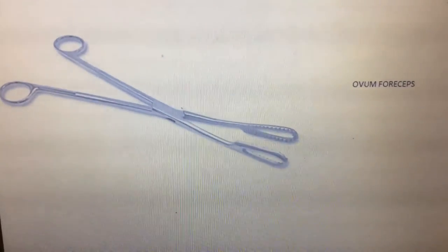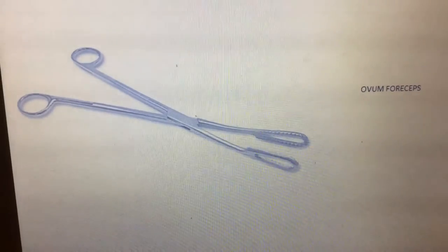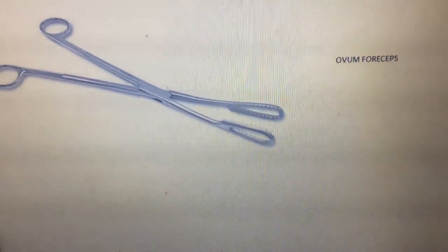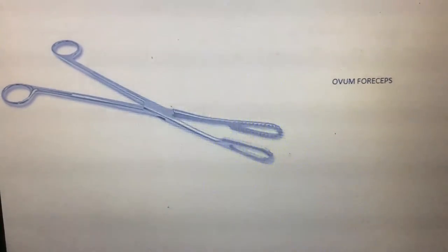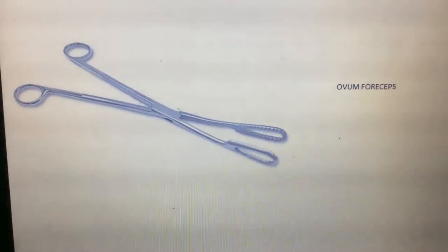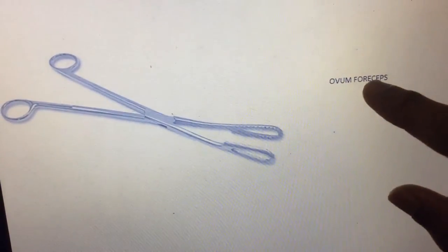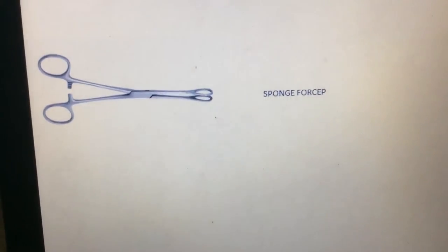This one is known as ovum forceps. The tip is shaped like a tennis racket. It is mainly used to remove placental fragments from the uterus, and also for other clamping purposes. It is mainly used in gynecological procedures. This side is slightly curved. The other type is the sponge forceps.